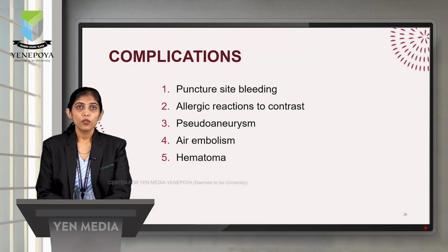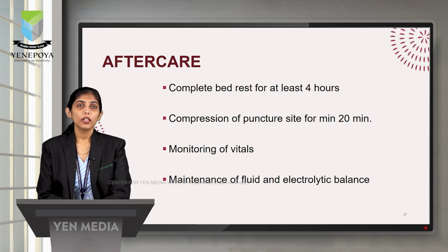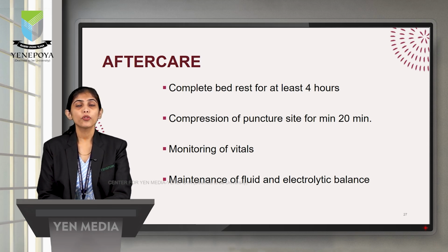The complications of this procedure could be puncture site bleeding, allergic reactions to the contrast, pseudoaneurysm, air embolism, or maybe hematoma. Aftercare: we will ask the patient for complete bed rest for at least 4 hours. Then compression will be given at the puncture site for a minimum of 20 minutes. We'll be monitoring the vital signs and we'll ask the patient to drink a lot of fluids to maintain the electrolyte balance.